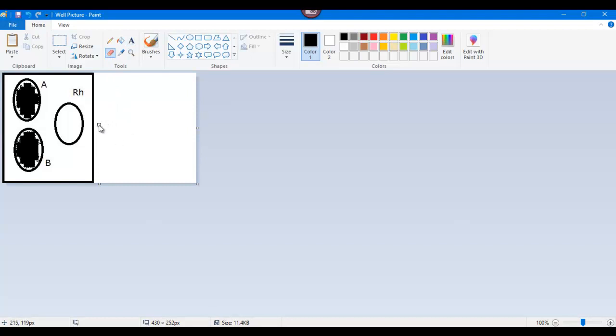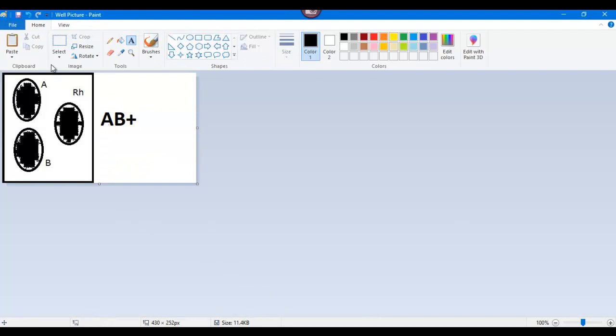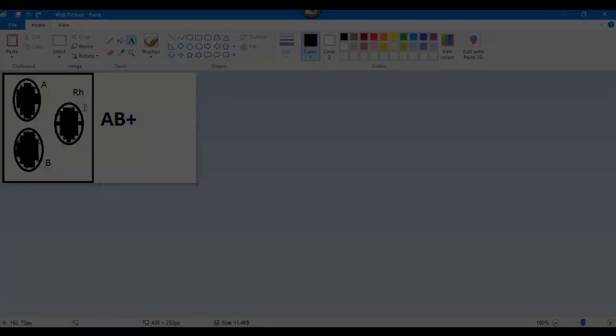That takes more time than anything. So if you come back and all of these have clumped together, you did your little test and you came back, this person is AB positive. A because the A antigen, B antigen, and they also have the RH factor. So that's the two AB examples in blood typing, trying to determine it.